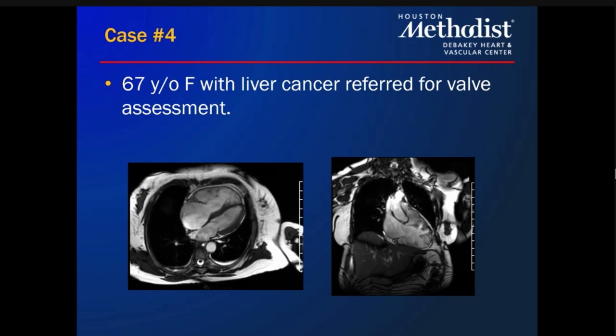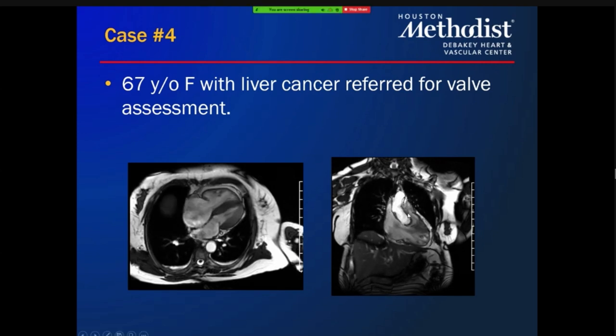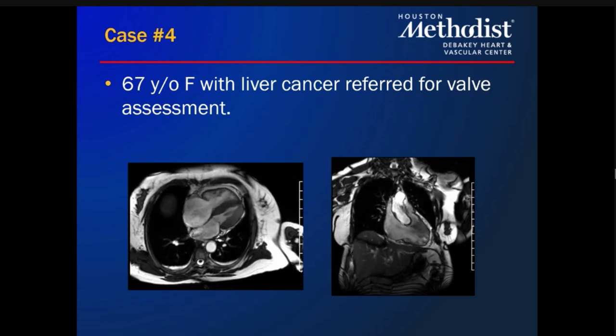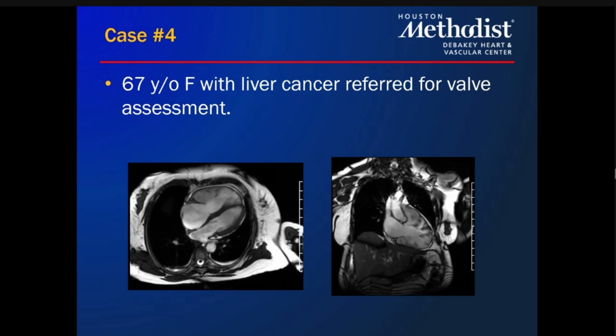What do you think of the valves? Obviously. Okay, so there's an apical displacement of the tricuspid annulus, I think. The clear abnormality is there's rip roaring TR here, I think. Yes. And if you look at the RV three-chamber view, what do you think of the pulmonic valve? Okay, so in the three-chamber view, it looks like there is also stenosis. Yes. As well. So this is starting to look like pulmonic stenosis.